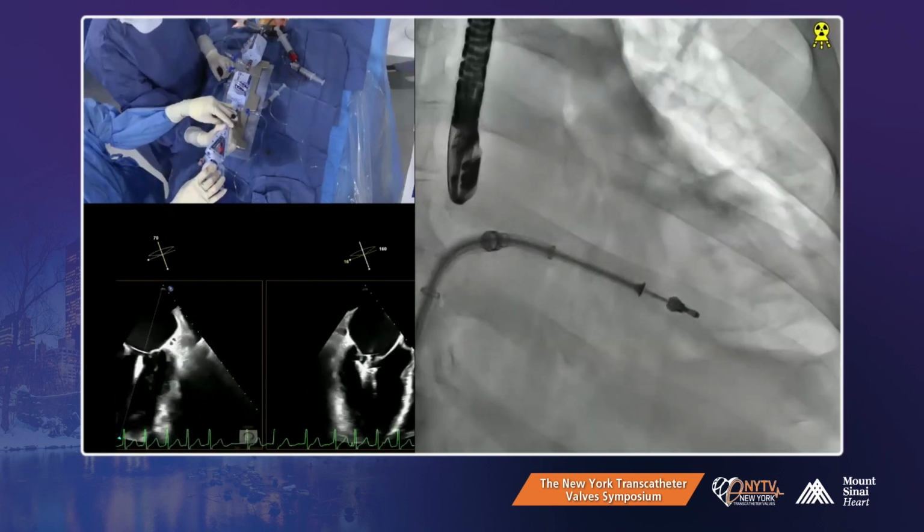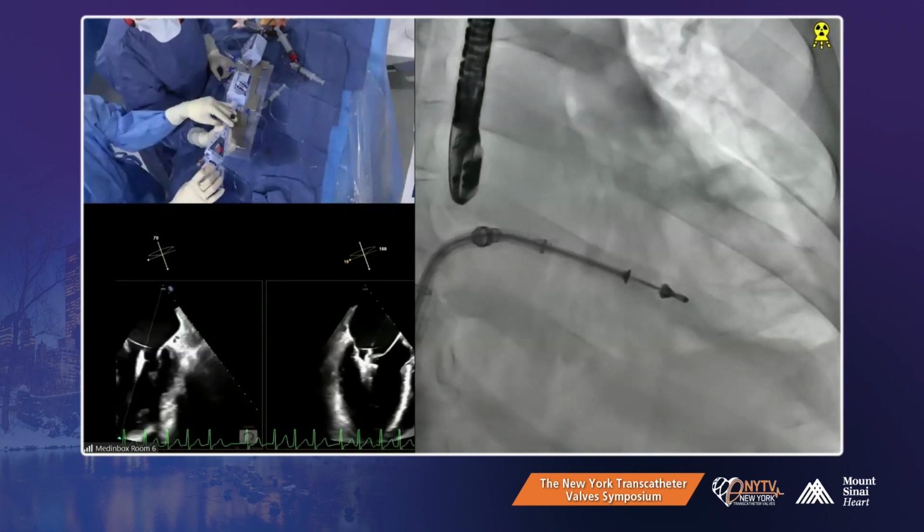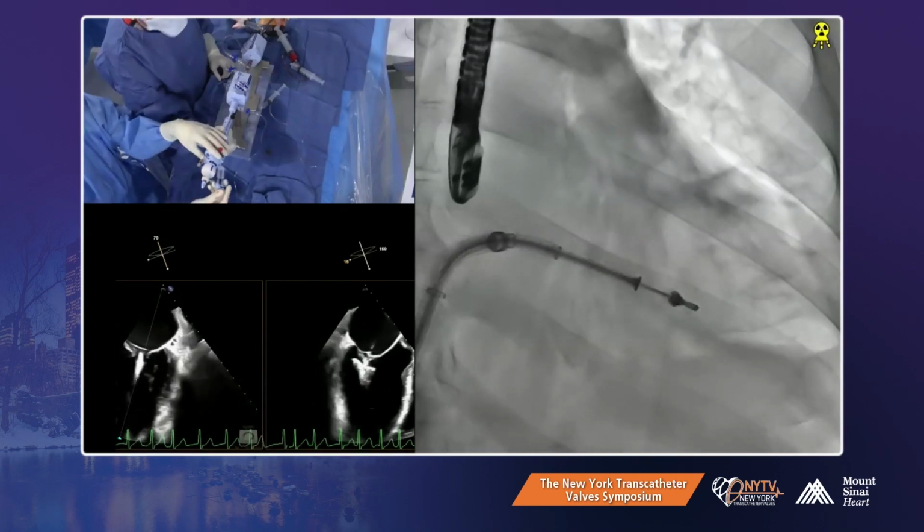You could also use Dex, just a little bit more. Yeah, we could do that. Okay, go to posterior now.